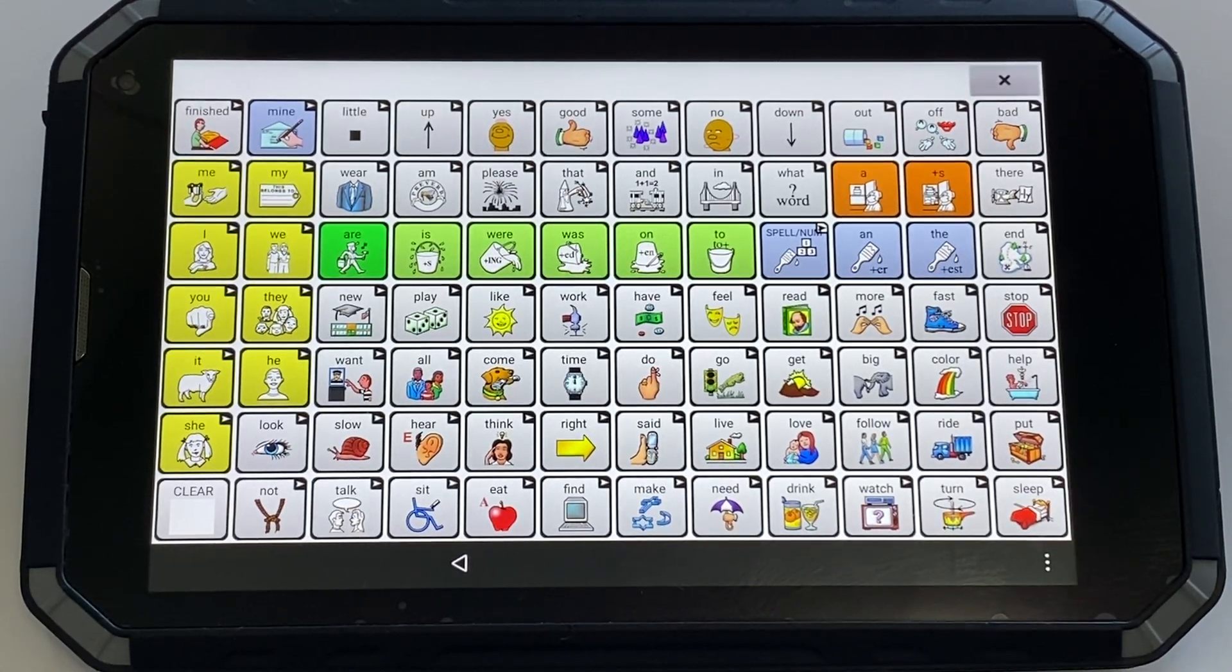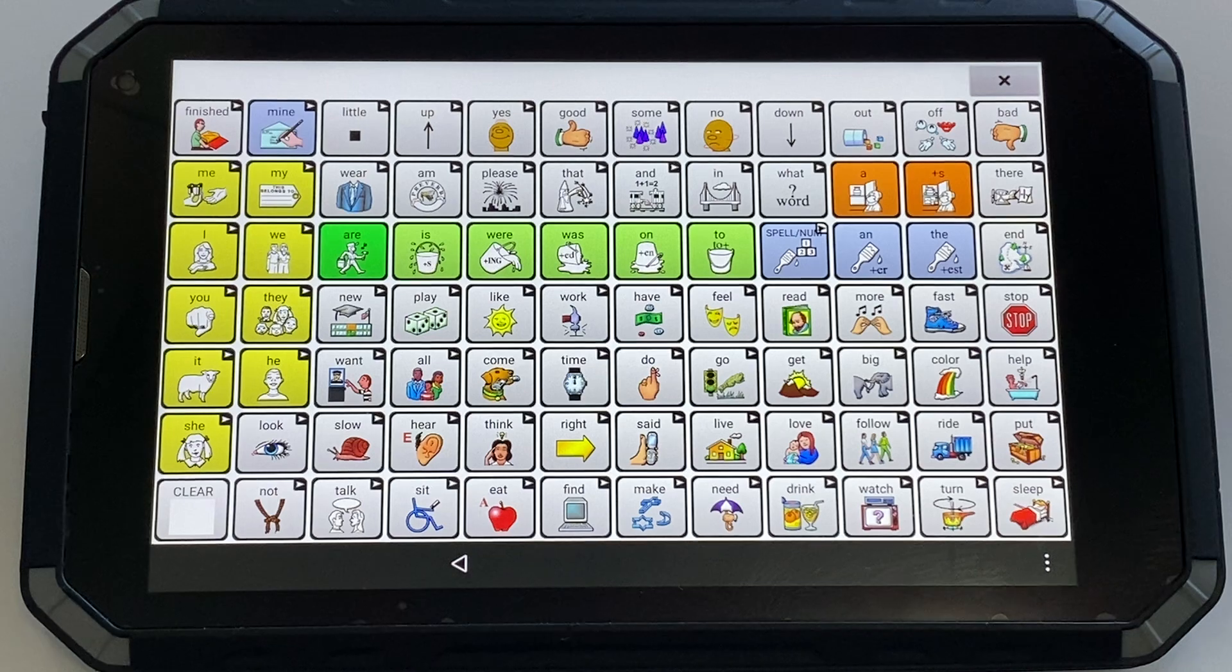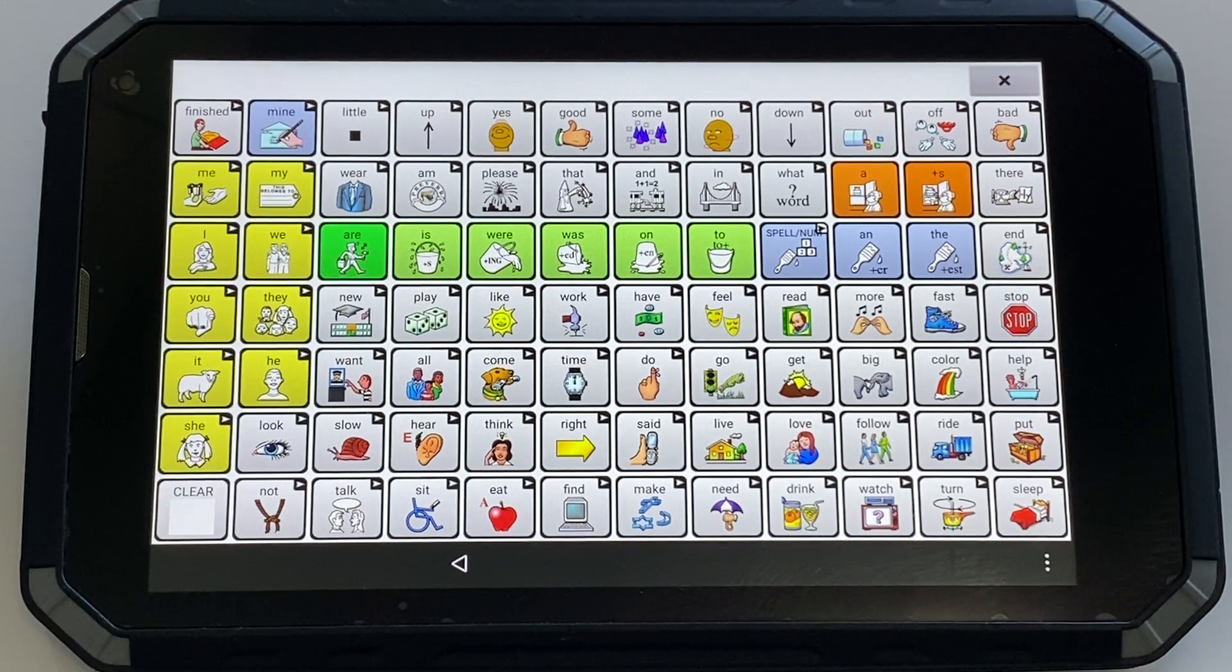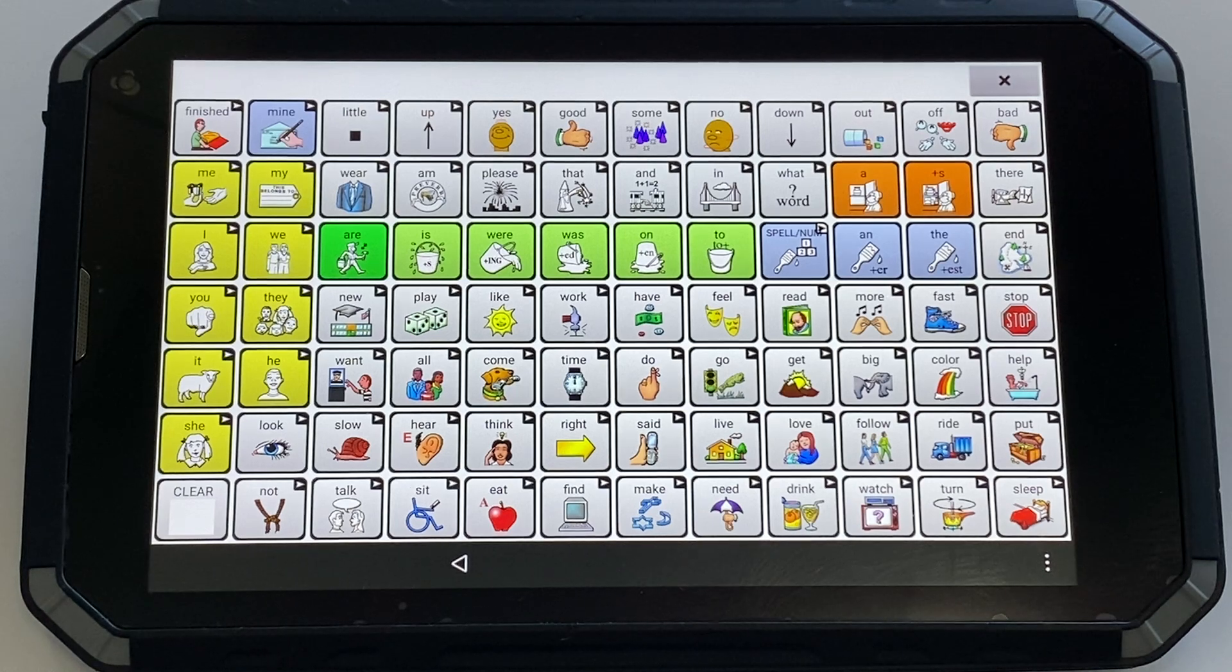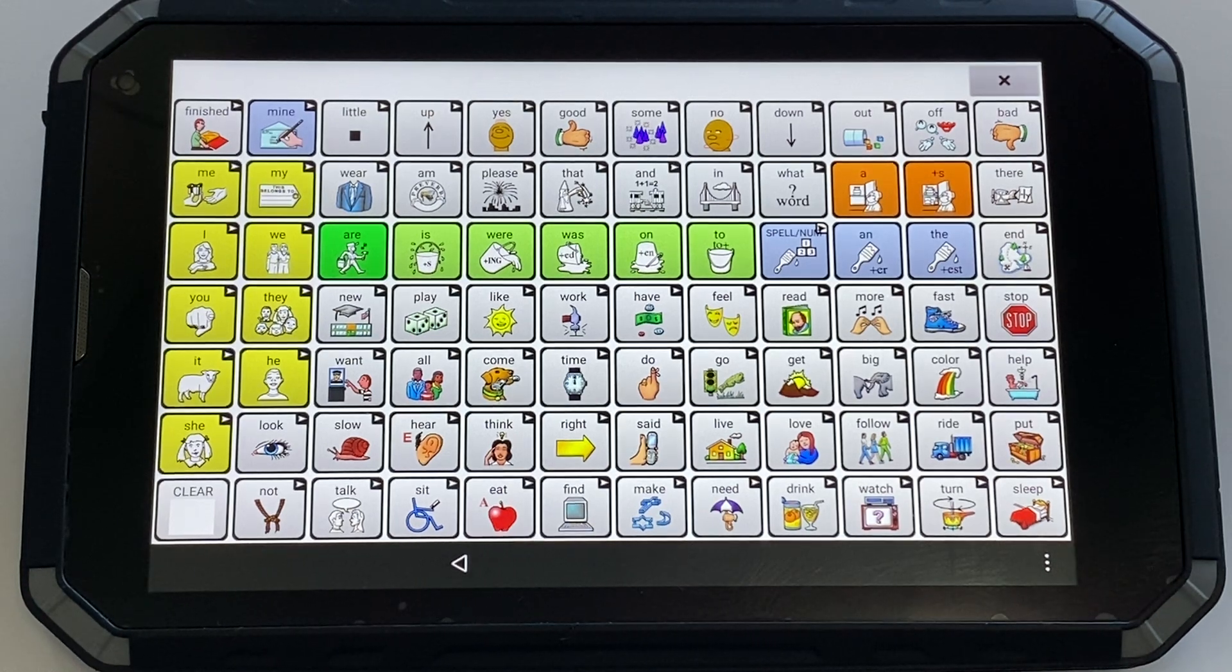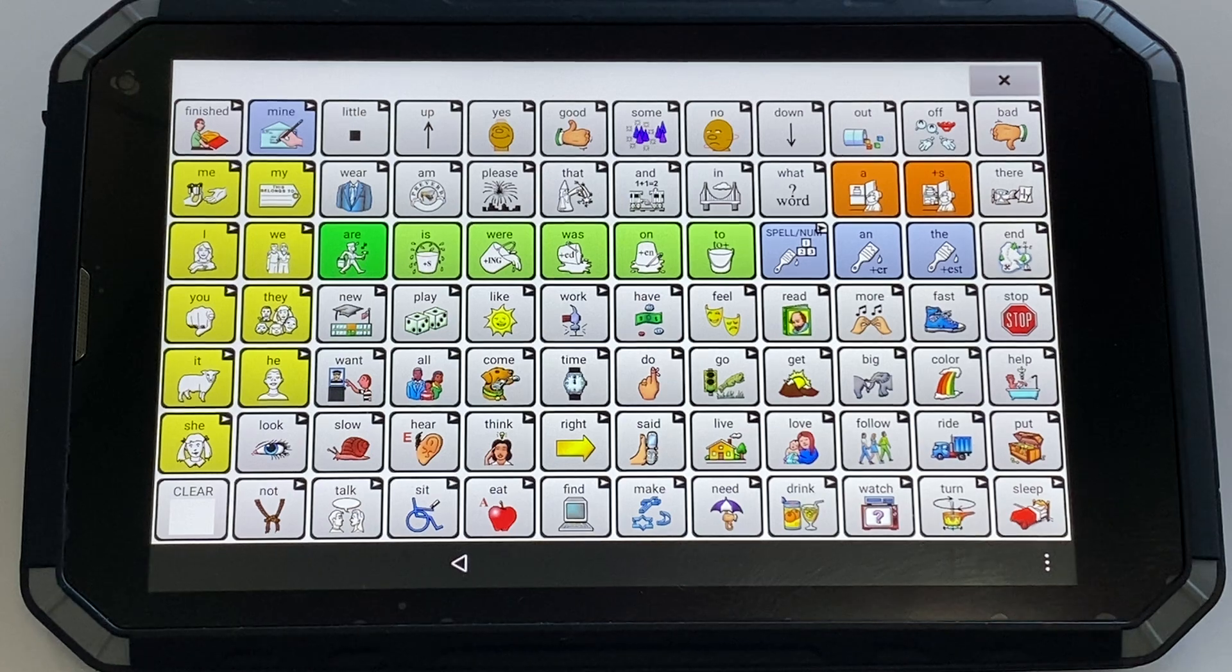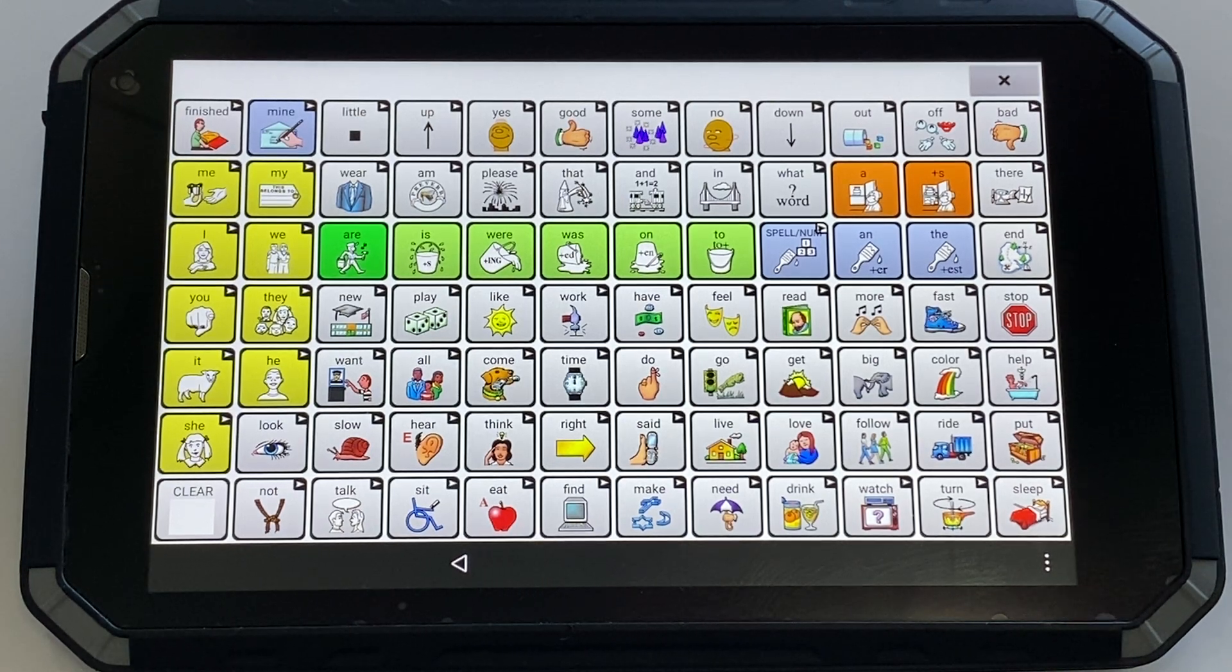Here is how you use the Vocabulary Builder on the rugged devices. Vocabulary Builder is an excellent tool to temporarily limit the number of words available on the display. It allows the individual to focus on a small set of target words whilst maintaining consistent motor patterns for those words.